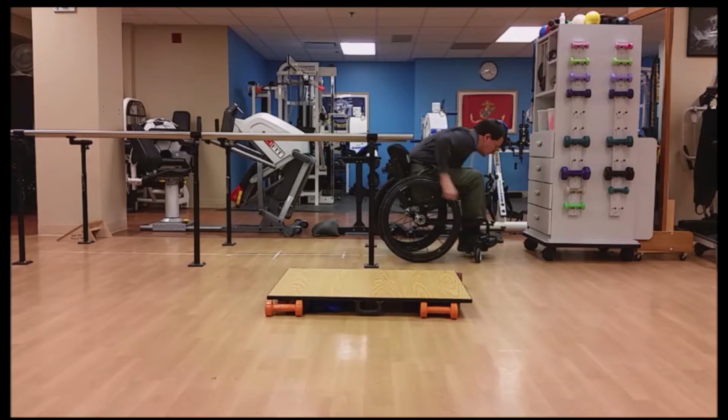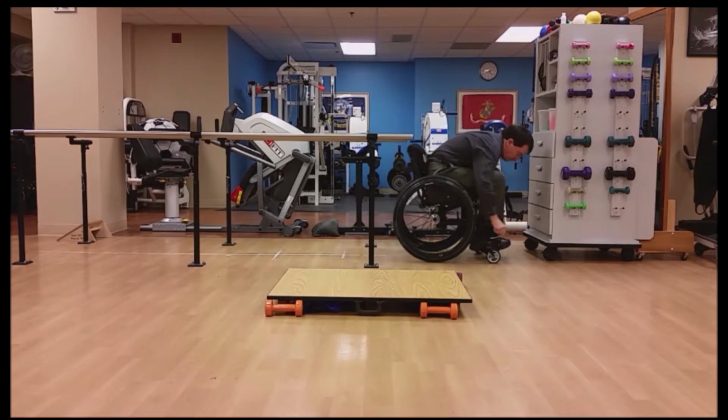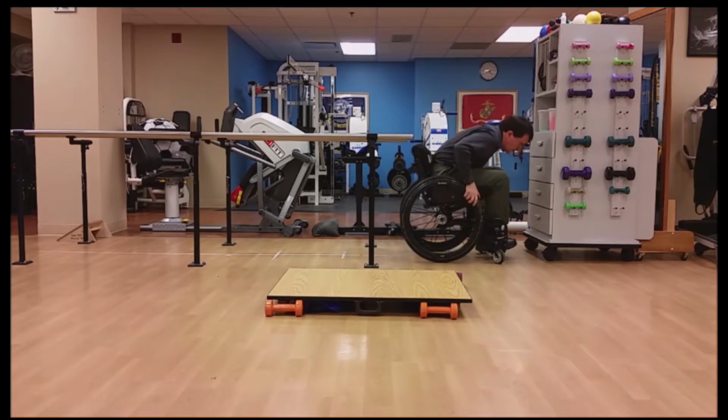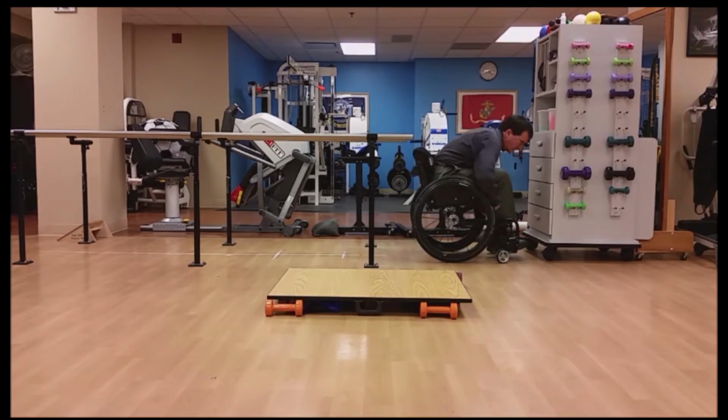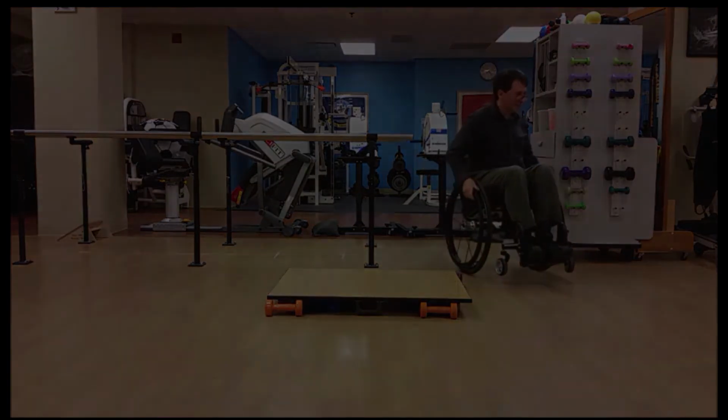This is what I said. I'm not recommending you get excessively front heavy chairs. It would be hard to wheelie. No, but this was a very unique thing, to have the ability to play around with center of mass adjustments and use it in all different types of circumstances. And it was pretty rapid learning as far as figuring out what was needed. So we're going to think of those concepts, and we're going to take those forward to normal wheelchair skills.